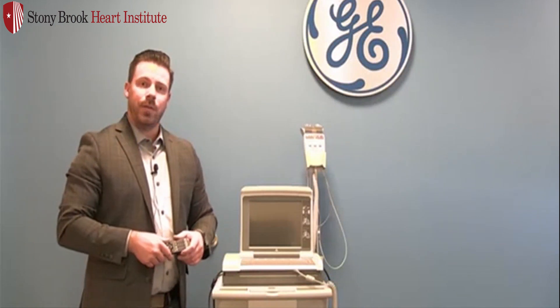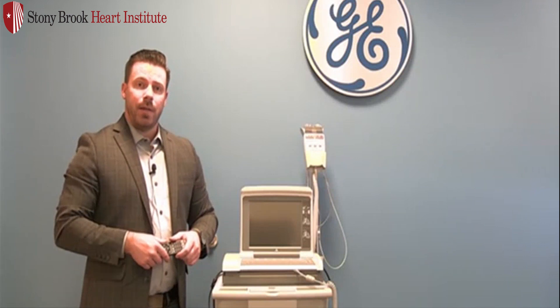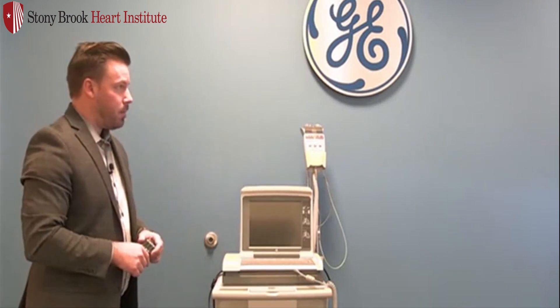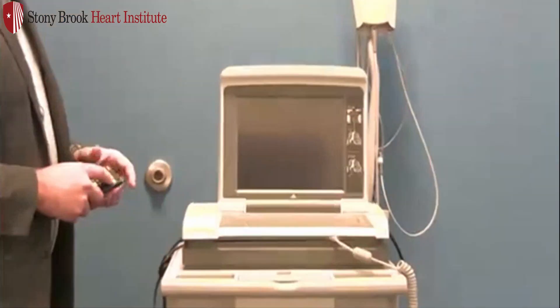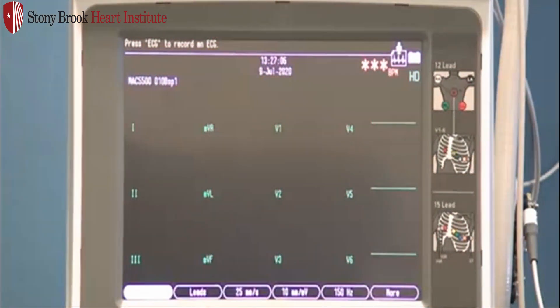Hello, everyone. Today I want to showcase the new feature with your MacView 5500. A new feature is going to be the barcode scanner. Power on your device by pressing the power button. The barcode scanner will give you a little beep and a buzz to let you know it's activated.